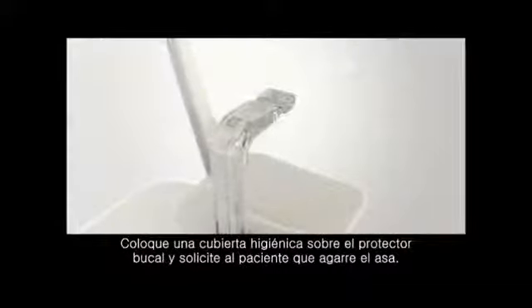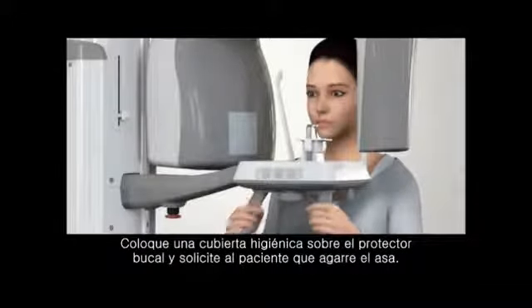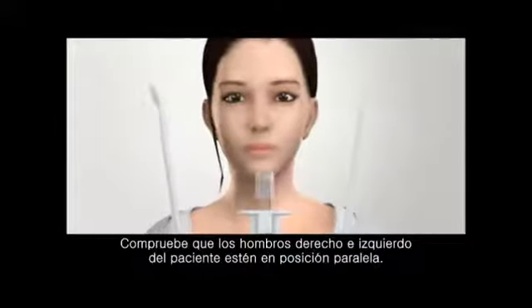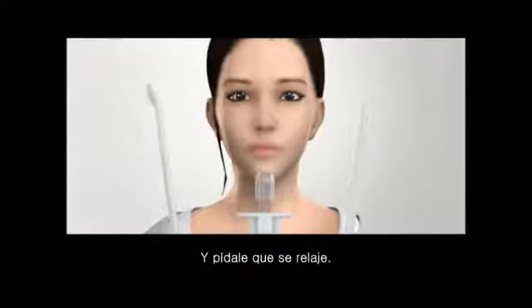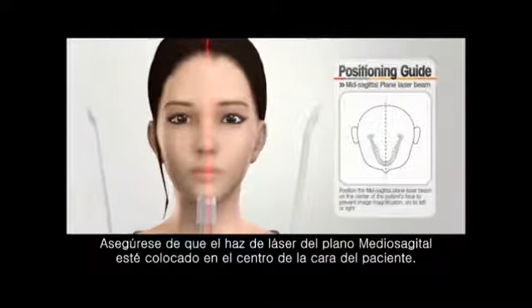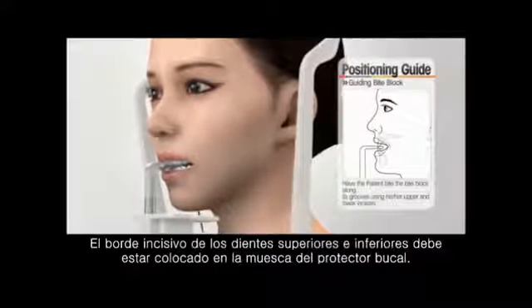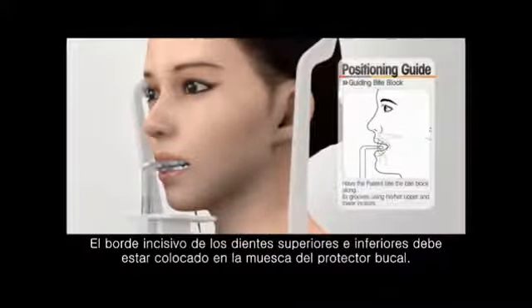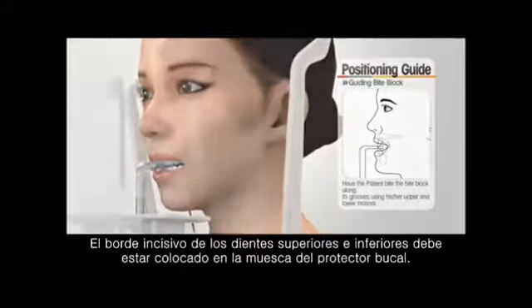Place a hygienic cover over the bite block and ask patient to grasp the handle. Confirm the patient's right and left shoulders are parallel and lead the patient to relax. Make sure that the mid-sagittal plane laser beam is positioned at the center of patient's face. Ask the patient to bite the bite block. The incisor edge of the upper and lower teeth must be placed on the groove of bite block.